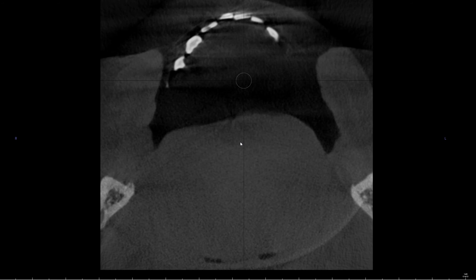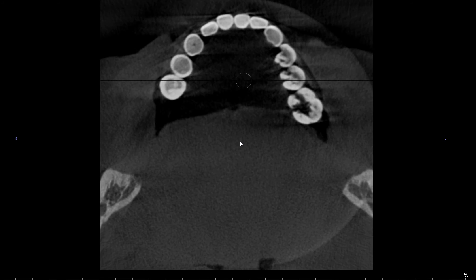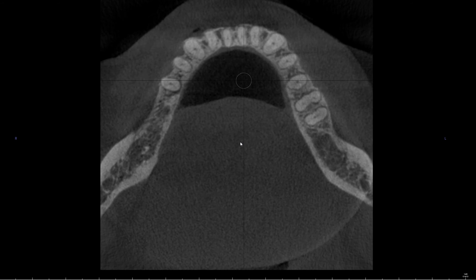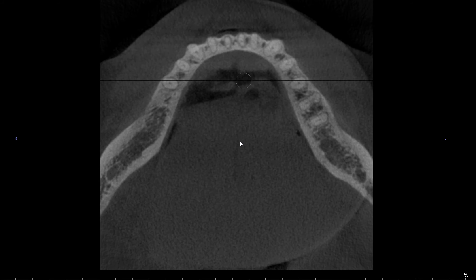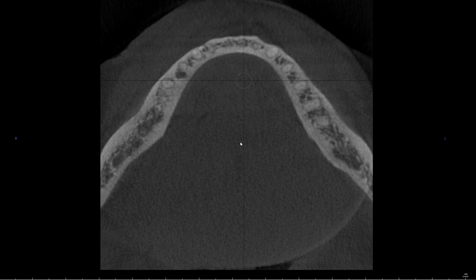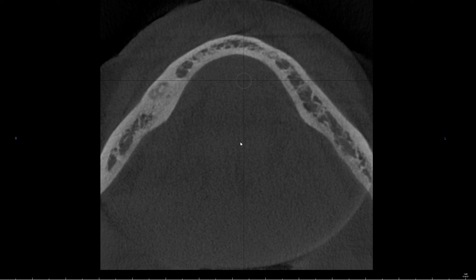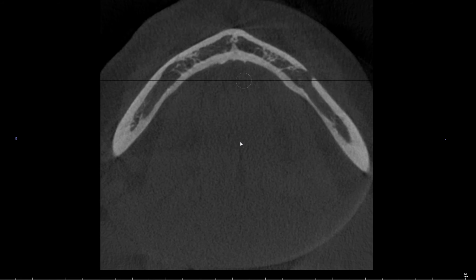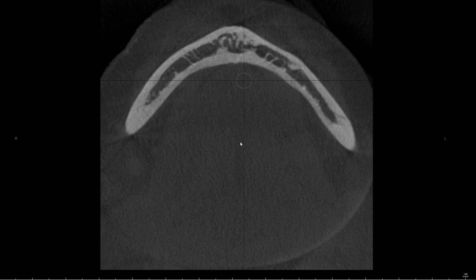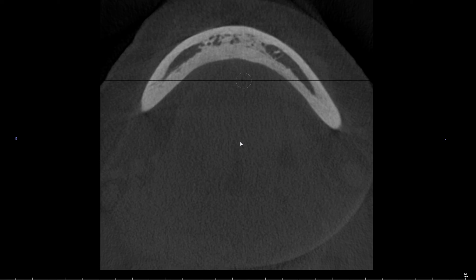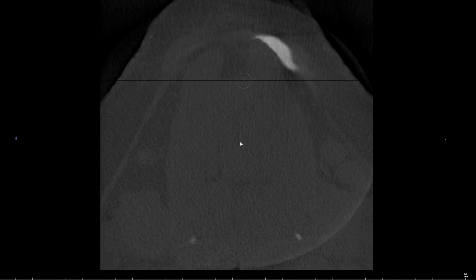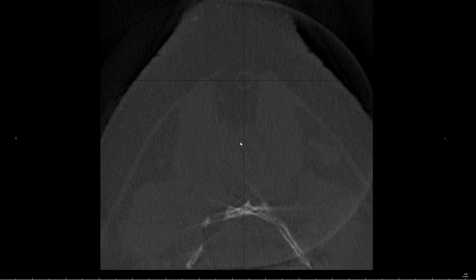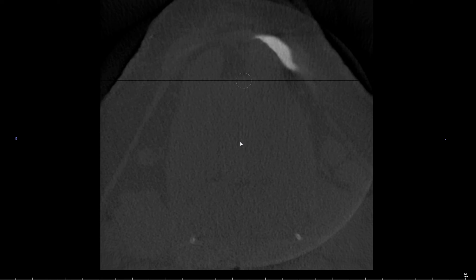Now we're going to the mandibular arch. Did you guys see a pathology? Let's give it another try.